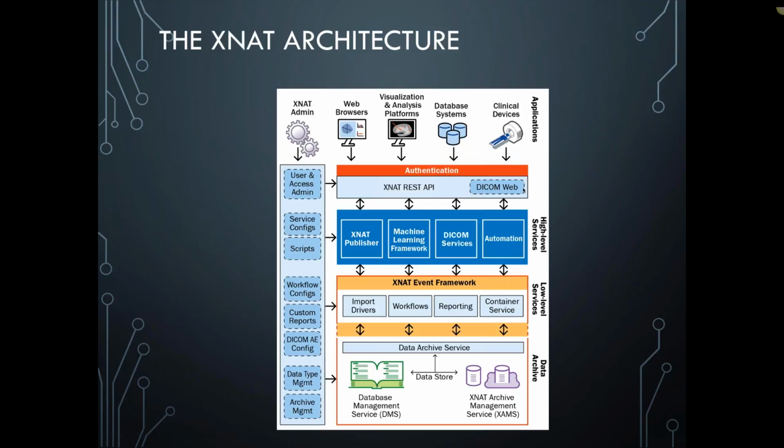But most of the interfacing with XNAT is through its RESTful API. So lots of other external applications, visualization tools and things like that can communicate with XNAT using more modern web communication.